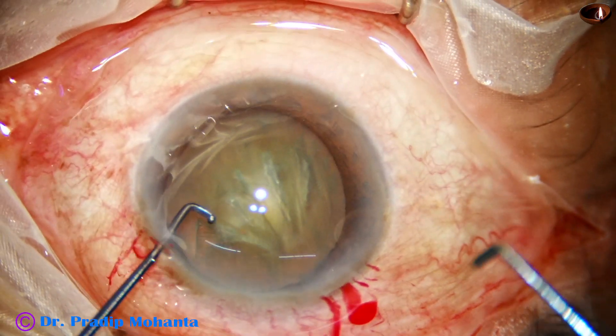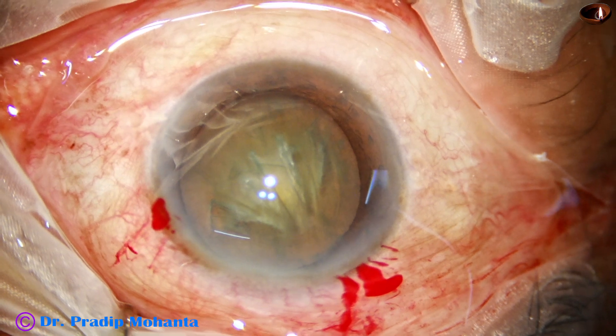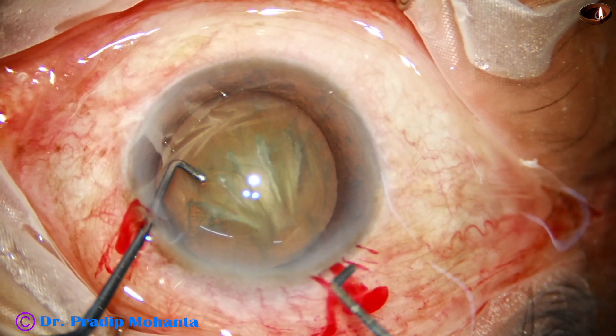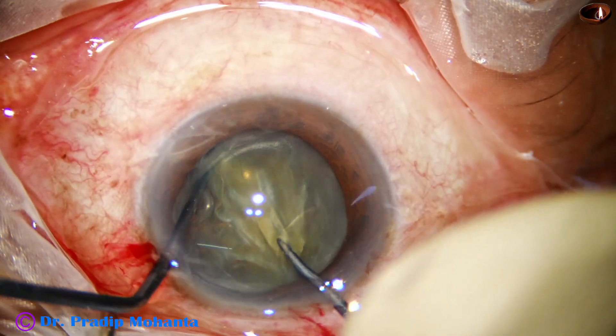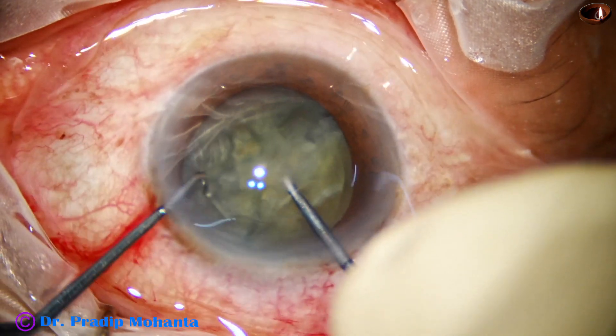The pre-chopper has a cutting edge in the front. It is embedded in the substance of the nucleus, just in front of the main wound and just in front of the rhexis margin. The sustainer hooks the opposite equator. The two instruments come toward each other and we get a very nice crack.